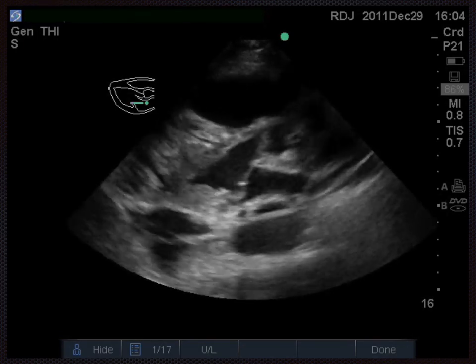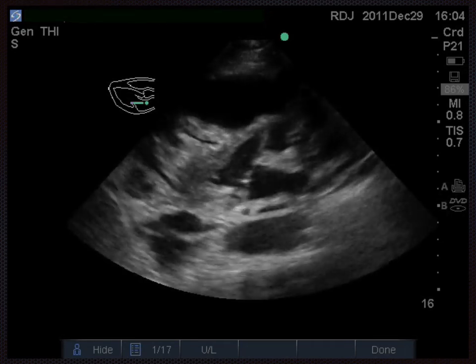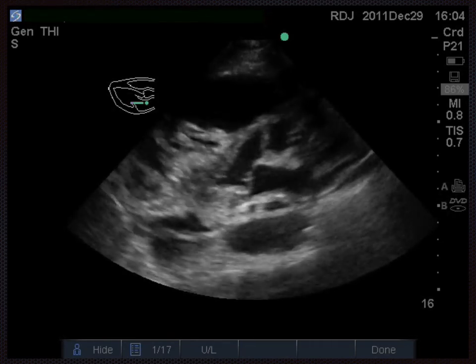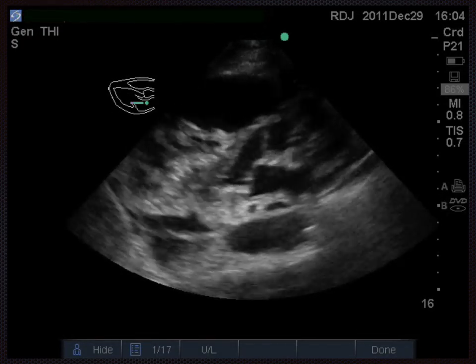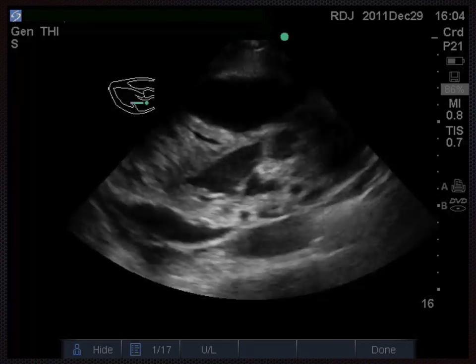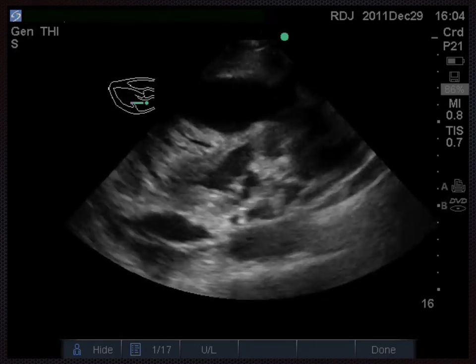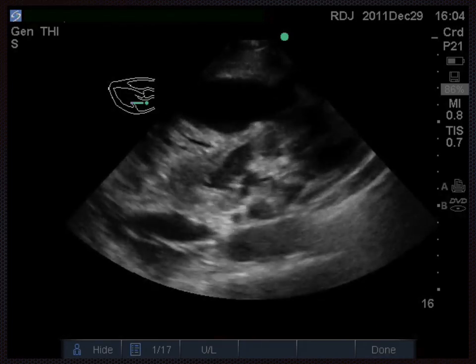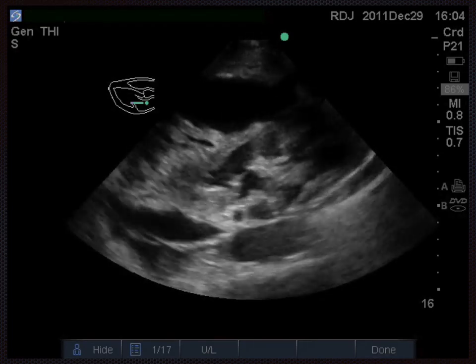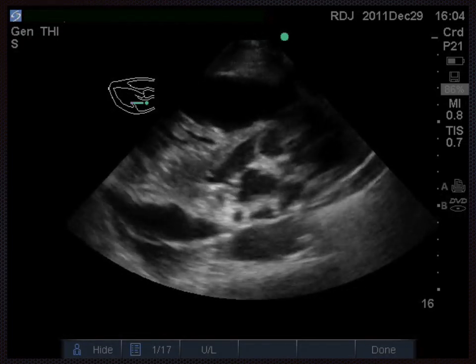And we know that the mitral valve leaflet tip should be less than 4 millimeters. So I would say that it's probably just within normal at the max, whether it's 3 to 4 millimeter thickened at the end. But certainly looks like it's opening and closing, and it looks fairly normal, although there's a slight thickening to the tip, which is probably just within normal limits.